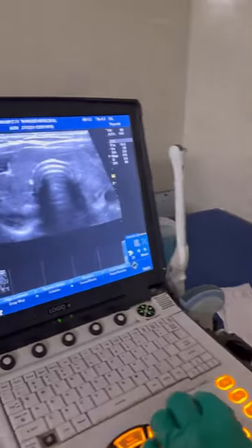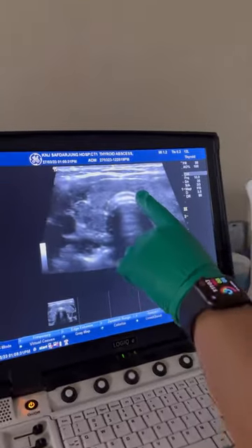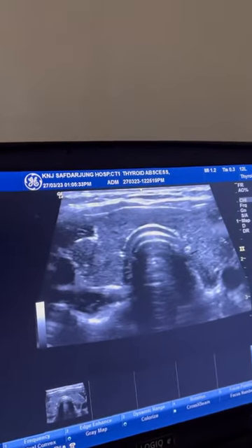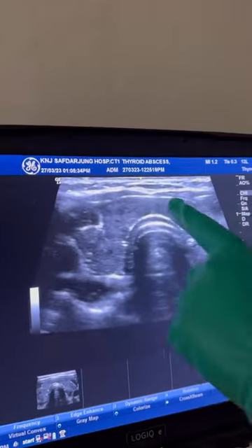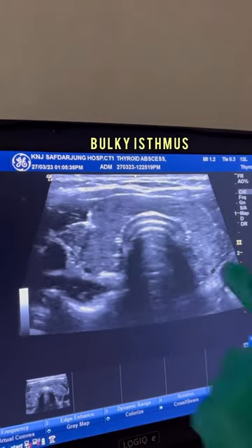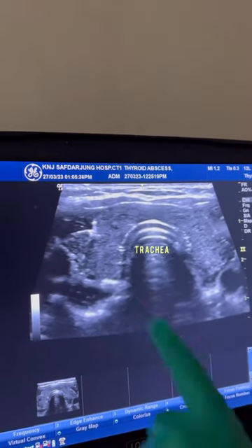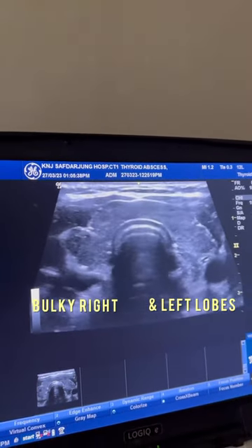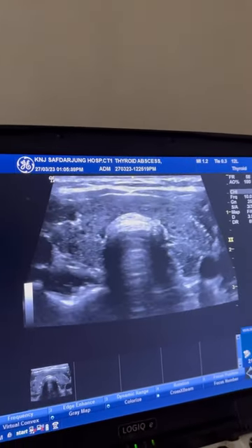This female has hypothyroidism. We can see that the isthmus of the thyroid gland is bulky. This is the trachea, and the right as well as left lobe of the thyroid gland are also bulky.